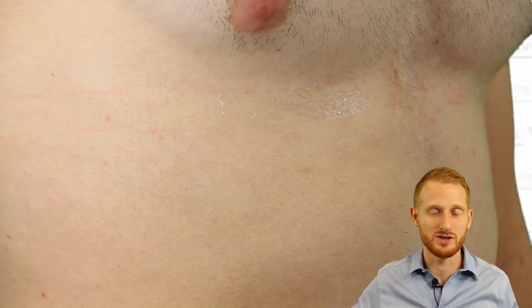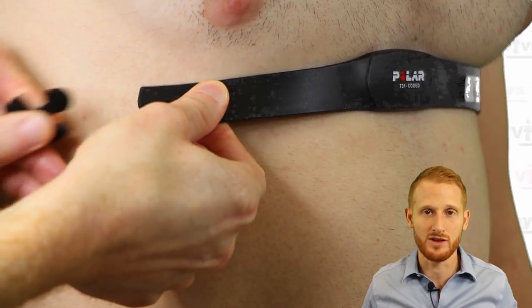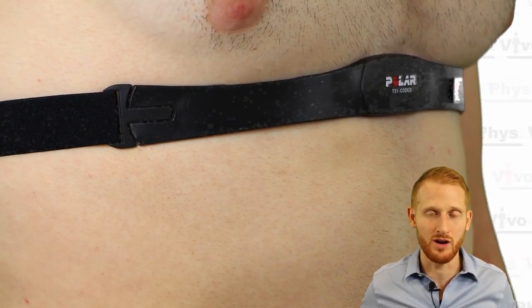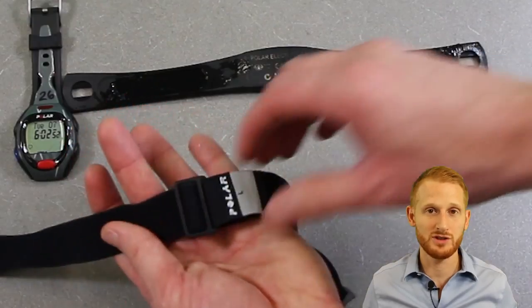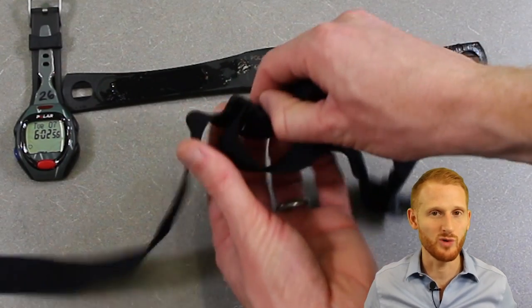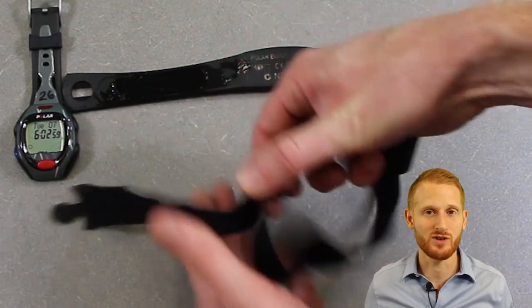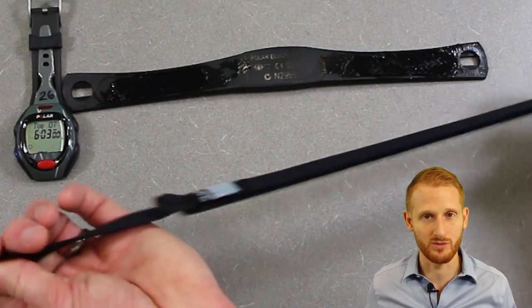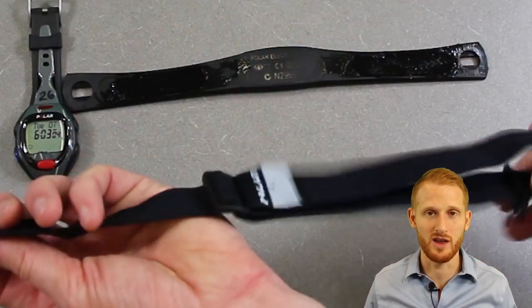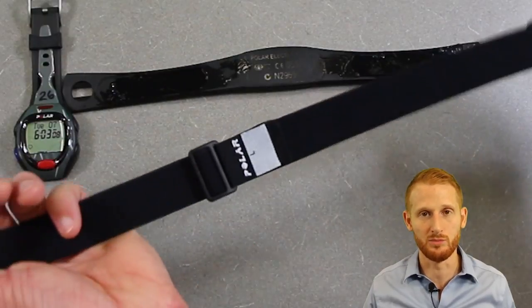Then take the strap around the person and connect it to the other side of the hard part of the heart rate monitor strap, just like you did on the first side. Make sure the strap is tight enough so it's not going to shift and move around when the person is moving and exercising, but not so tight that it makes it difficult to breathe or is uncomfortable. The straps are adjustable — they can go longer or shorter by moving the elastic part of the belt back and forth across the buckle.